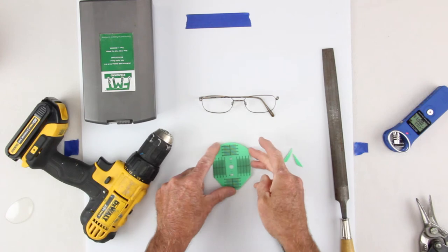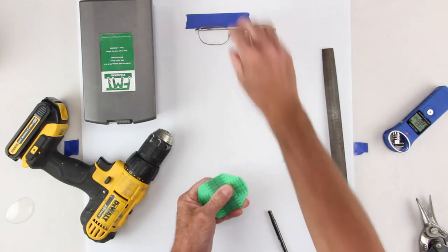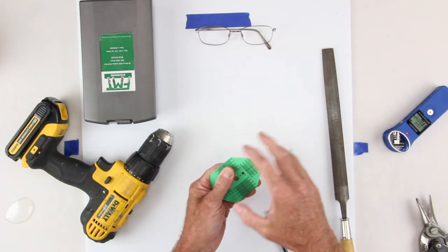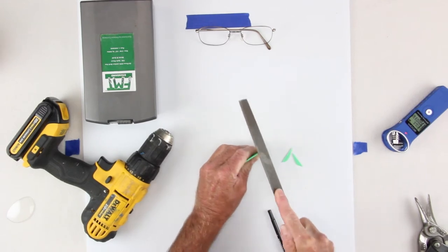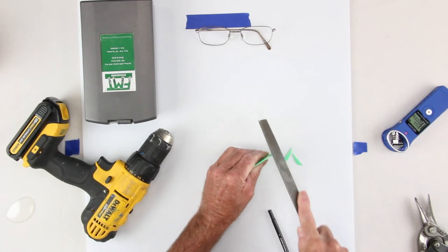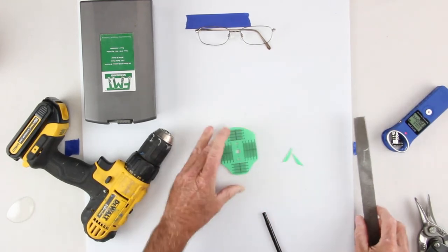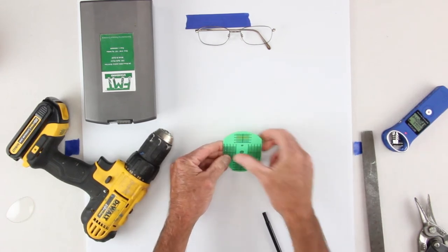And what I'm going to do is I'm going to try to take this file here and do this. I don't think I'm going to be able to. I'm probably going to have to take it into the workshop. I'll move everything in there. But let me see if I can just... All right, well, that's not too bad. I can kind of live with that. I got a little skull action going there.